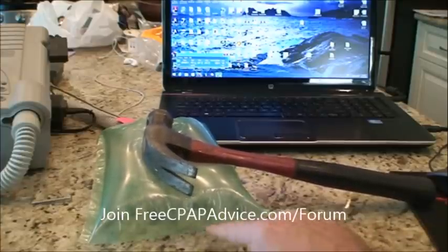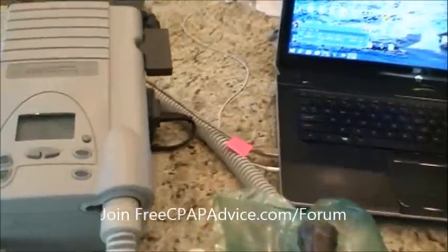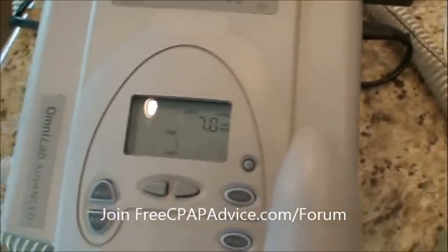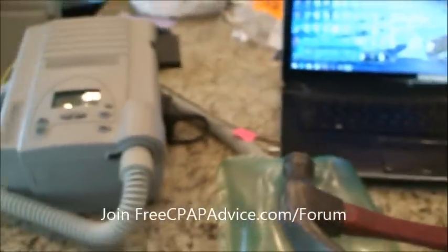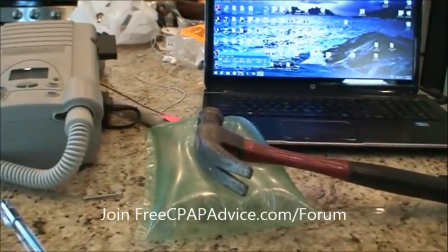Again, better, the airway is protected. Maybe this person's still suffocating just a little bit, it's hard to say. Leak is at 18. Looking at our machine over here, it's supposed to be blowing 7, and it is blowing 7. So supposed to be, and what it actually is blowing. So everything's still really good here. Basically no leaks to speak of at all.